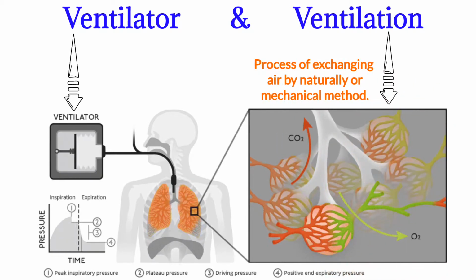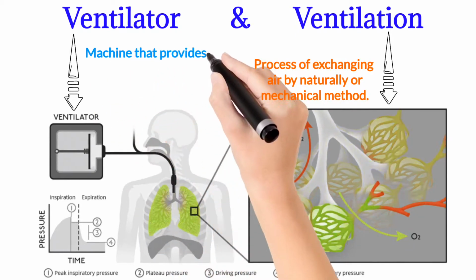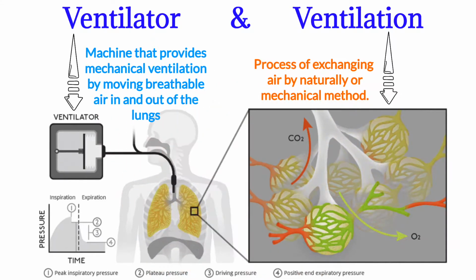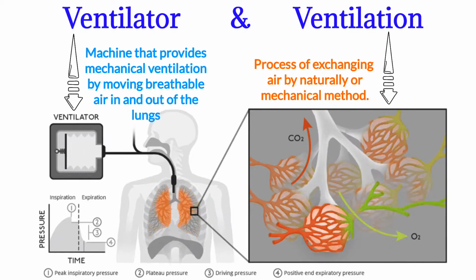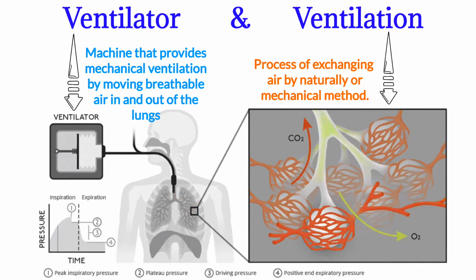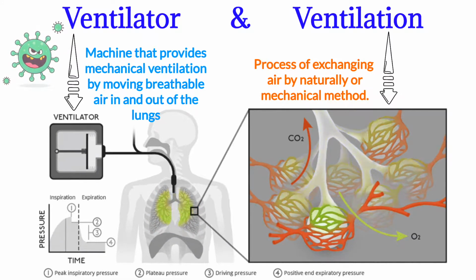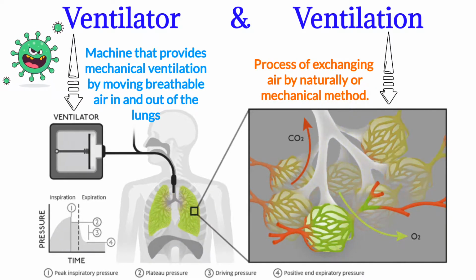To deliver ventilation to a patient who is physically unable to breathe, or present with breathing insufficiency, a ventilator is needed. A ventilator is a machine that provides mechanical ventilation by moving breathable air in and out of the lungs. In these pandemic days, ventilators are the most useful medical equipment for patients present with COVID pneumonia.